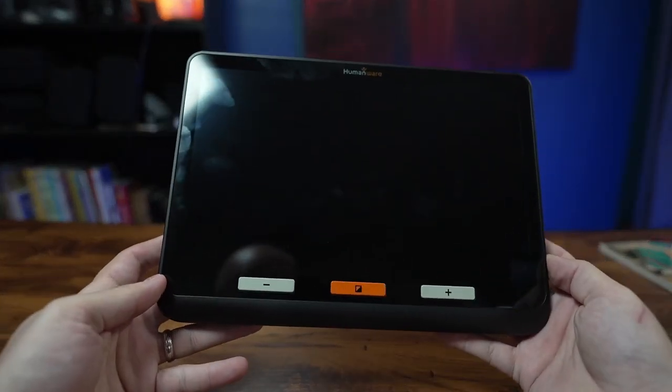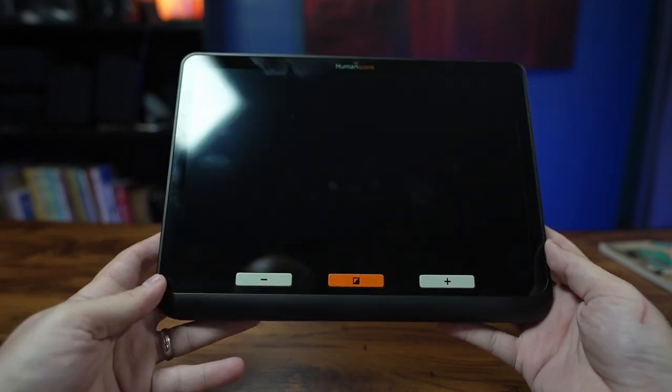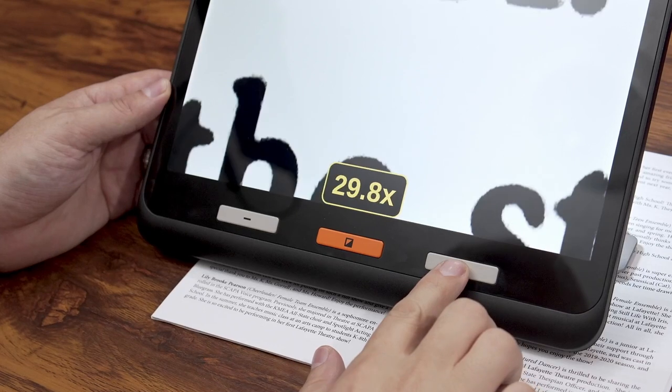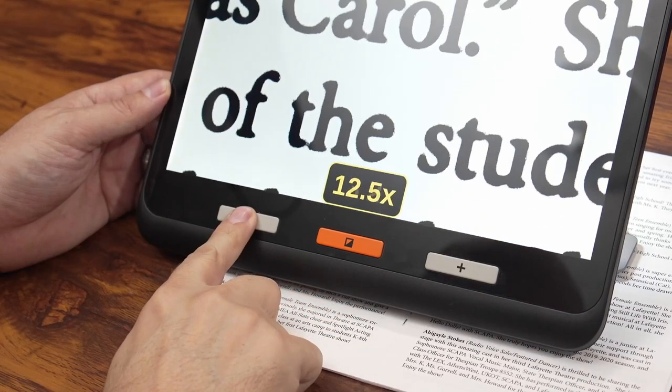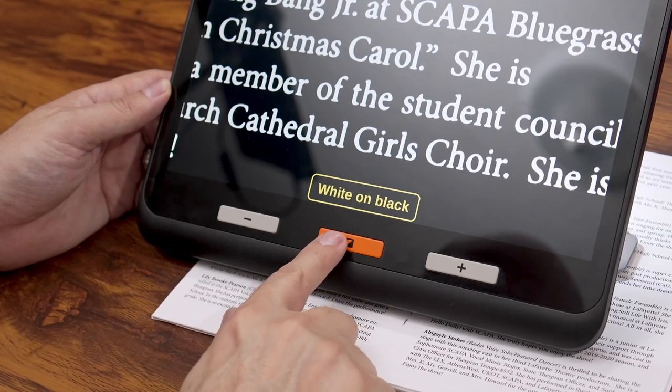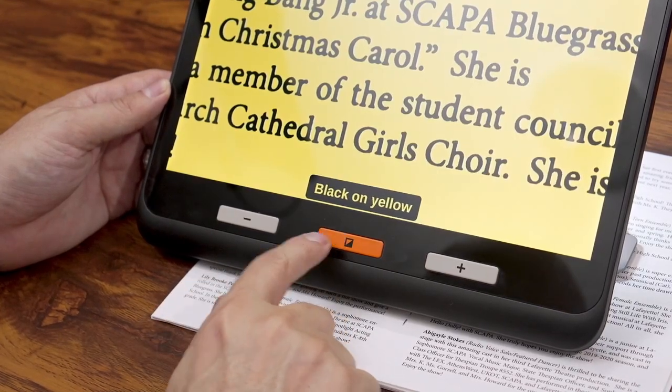For the hardware, we have a large 12-inch full HD screen — 1920 by 1080. On the front, you have three physical buttons: zoom in, zoom out, and your color filter button. Long pressing the color filter button also jumps you into the settings.